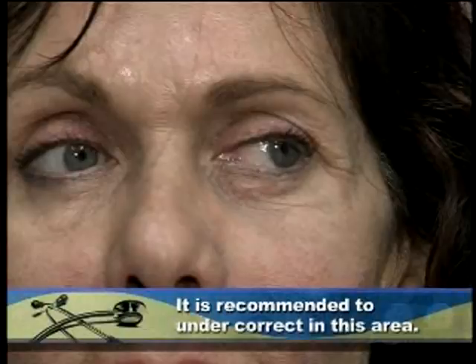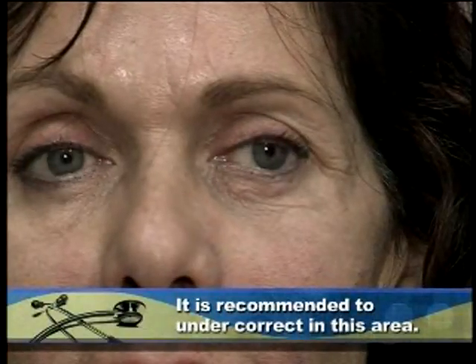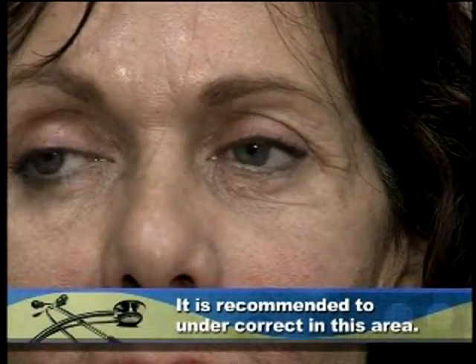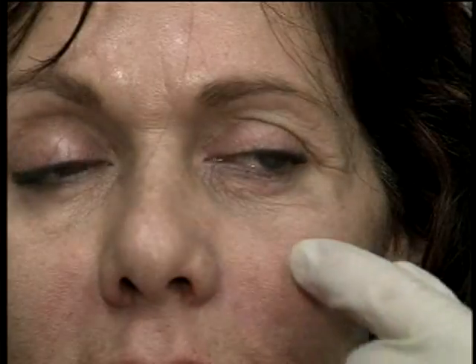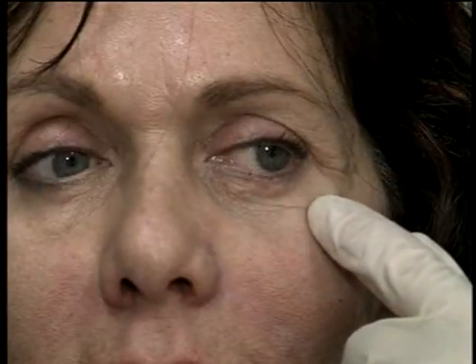I think it's very important to undercorrect in this area. If you treat to complete correction, you will see a lot of blue blebs that will form within the next couple weeks. So I think it's very important to undercorrect in this area. I can't emphasize that enough. And allow hydration to occur and for the area to be corrected, but do not overcorrect in this area. In fact, do not correct to complete correction, undercorrect. So I'll often use no more than 1/4 cc in this area, and I think that's adequate.